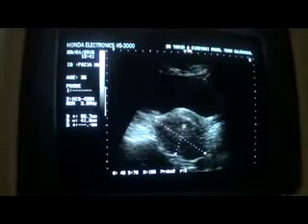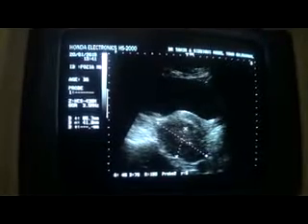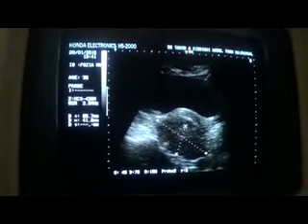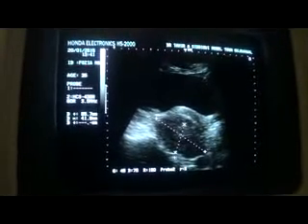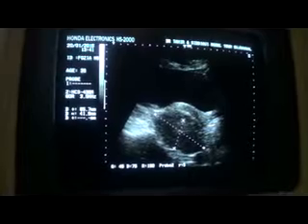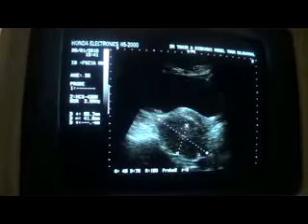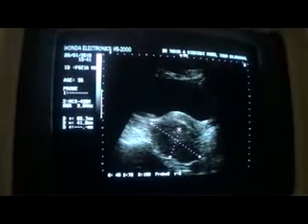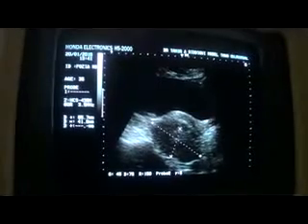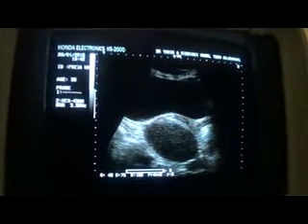Now I have picked this space. Let me explain the fibroid to you. This is the fibroid, totally hypoechoic. Now why is it solid? Because we do not see any posterior wall acoustic enhancement, and secondly, we can see the posterior wall of this mass or fibroid clearly. So this is the longitudinal section, and in this we see this hypoechoic mass with no internal calcifications or any other finding. It's very well demarcated.